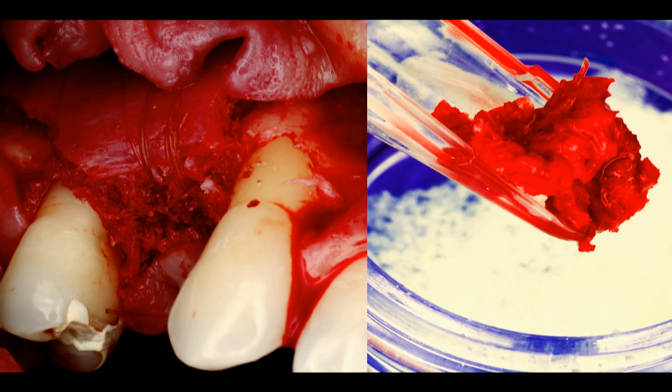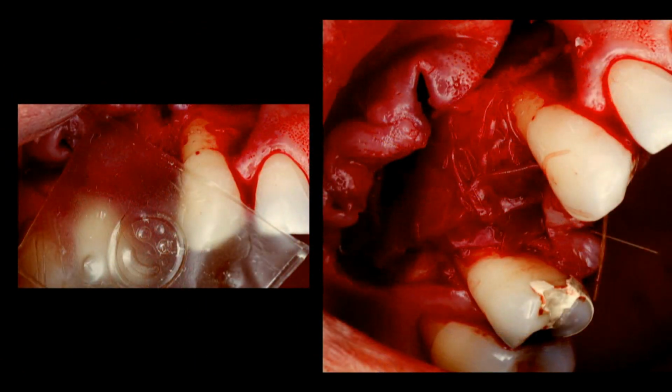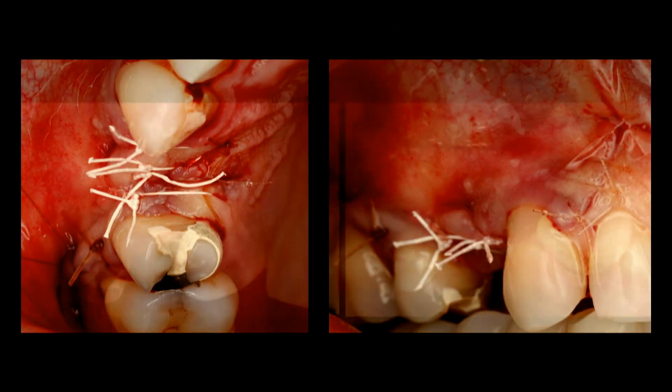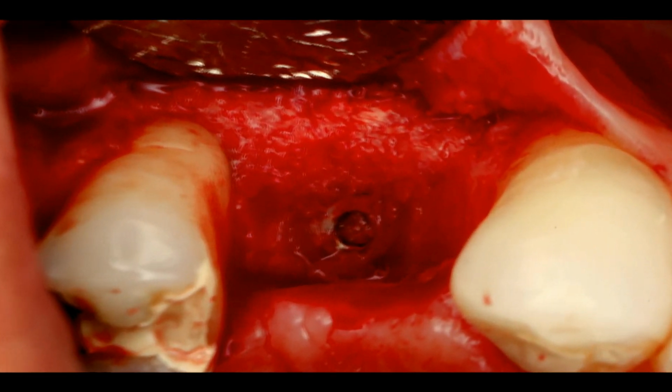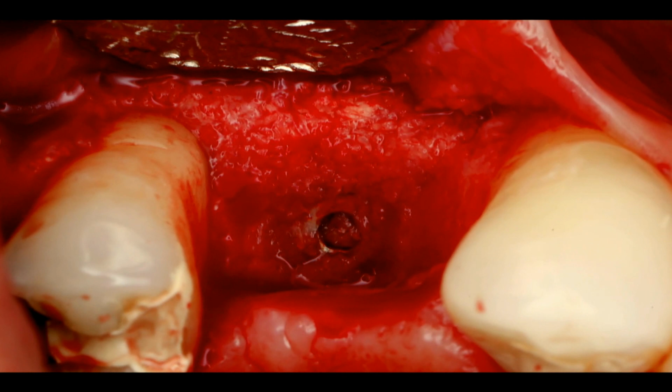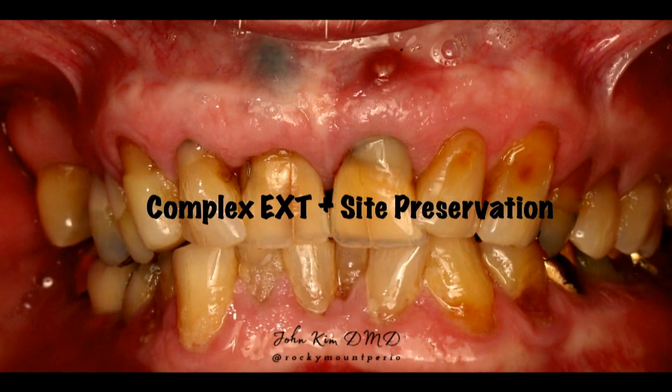You can't really see the distal ones because they were 6-0, but there's a distal periosteal biting suture and one on the mesial. And then again, I have good space maintenance here, but I want something to go over that buccal-occlusal line angle that's easy to place, that doesn't have to be screwed or tacked down, because I already have good space maintenance. So this just sucks down right over that site. Here we have our closure. And then, again, you can see beautiful healing. And you're going to see this in a lot more challenging cases later this afternoon when Dr. Puterman goes. But this is really showing you beautiful incorporation. You see that implant, again, covered by bone. So this works really, really well.